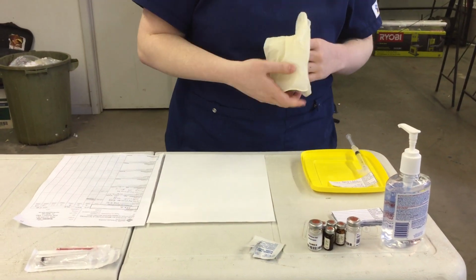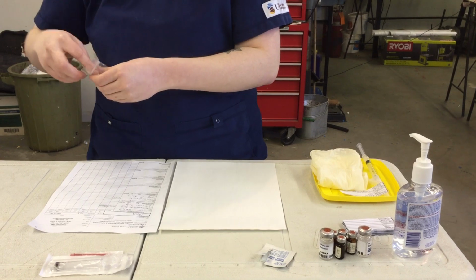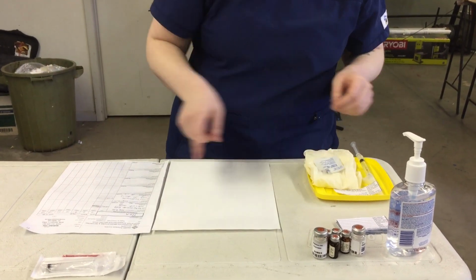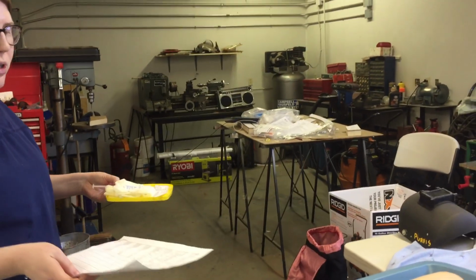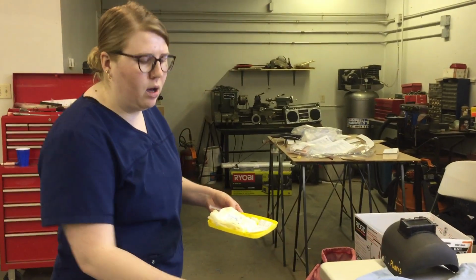So I'm going to get my clean gloves, my cotton ball, an alcohol swab and my MAR, and I'm going to wash my hands before I enter the patient's room. I'm going to be signing my MAR today with a pencil just for demo purposes, but I want to note that I would normally use a pen.